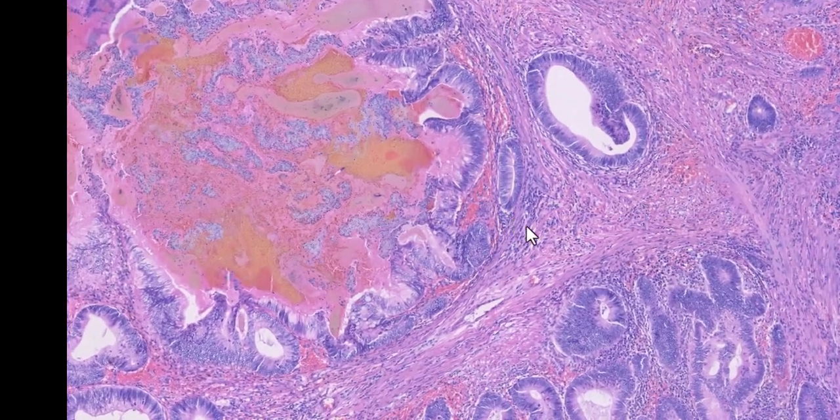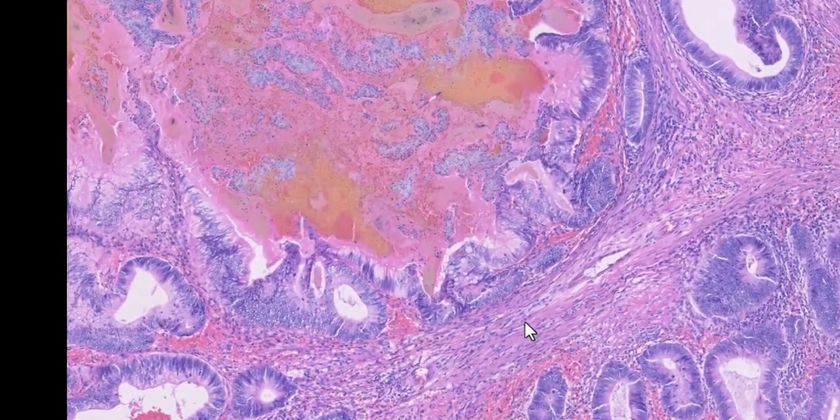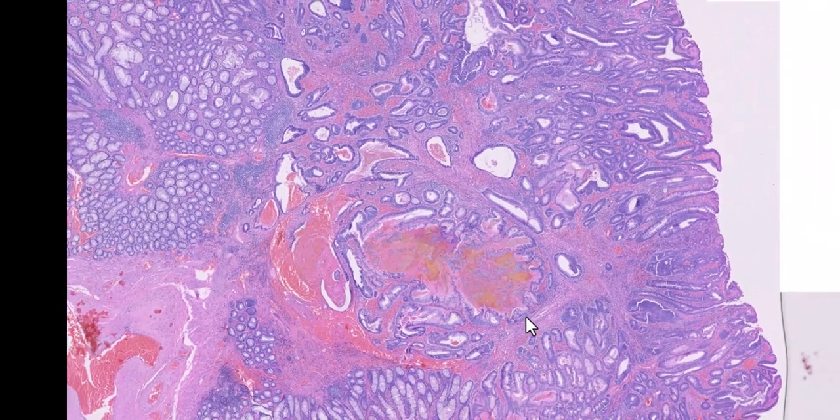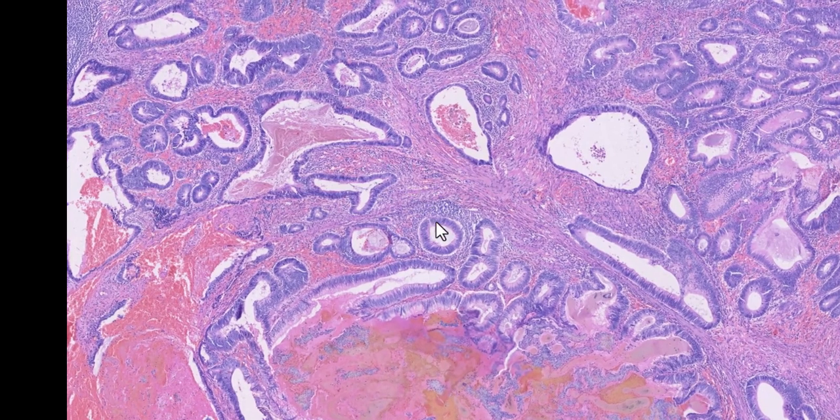There's no desmoplasia. In fact, there's a lot of smooth muscle. This misplaced epithelium is believed to be because of torsion, the torsion driving the overlying adenoma into the underlying submucosa, and along comes the lamina propria. You do not see desmoplasia, so there is no desmoplasia.